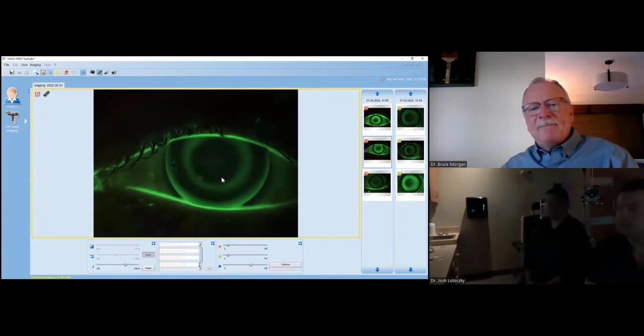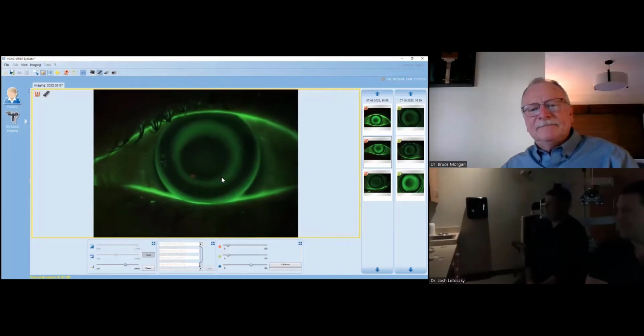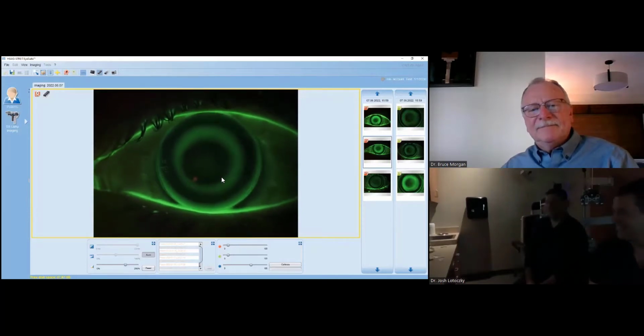She's giving us a little bit more of a ptosis. She's probably tired of sitting behind the slit lamp. She's actually shoved the lens down to center it a little bit better somehow.